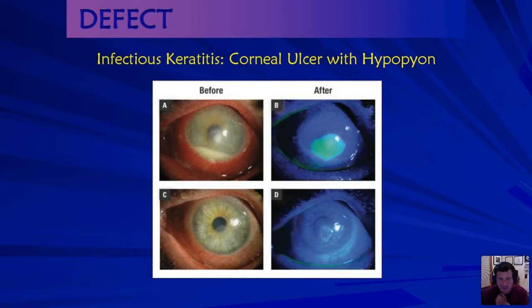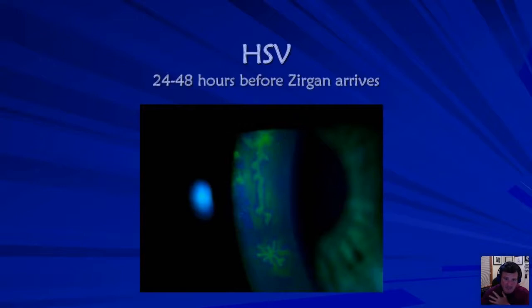And pay close attention here that this is an infectious keratitis. And ask yourself right now, because it's coming up, which amniotic membrane would you use in this type of infectious keratitis? It's one of two answers, or maybe one of three answers. Is it dehydrated or cryopreserved, or is it none of the above when it comes to treating an infectious keratitis like this?